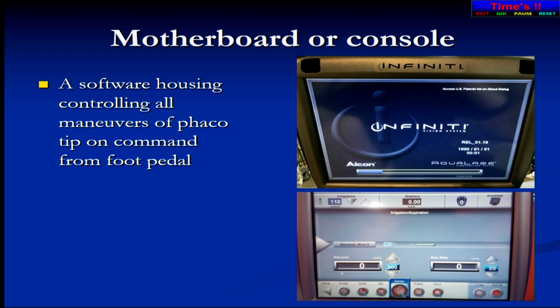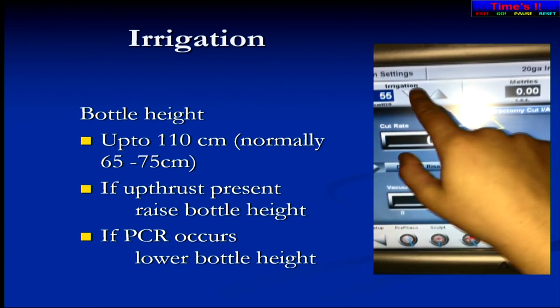Now in AIIMS Rishikesh, we have got Infinity. But there we have also got an AMO machine, which has been sold to, I think, Johnson & Johnson, a machine which again has power, outflow, and vacuum under my control. So that gives me better control. Still, I am much happier with those kinds of machines.